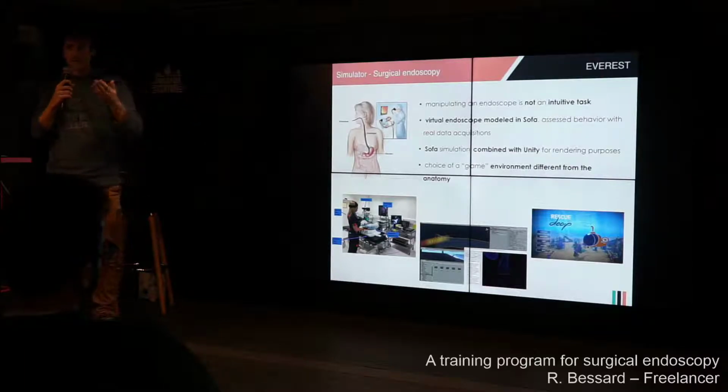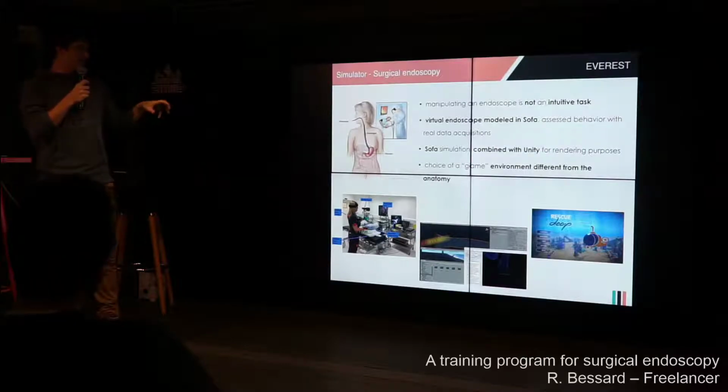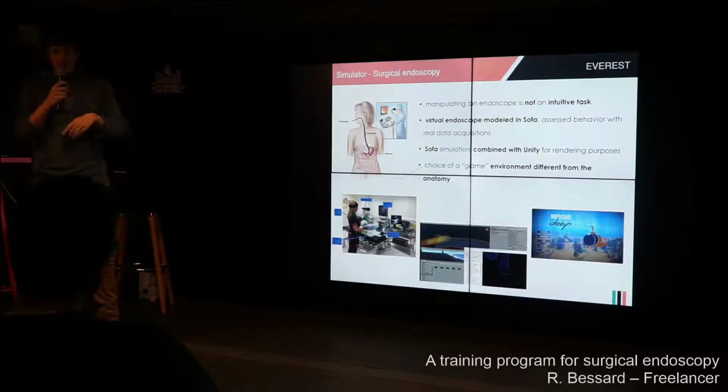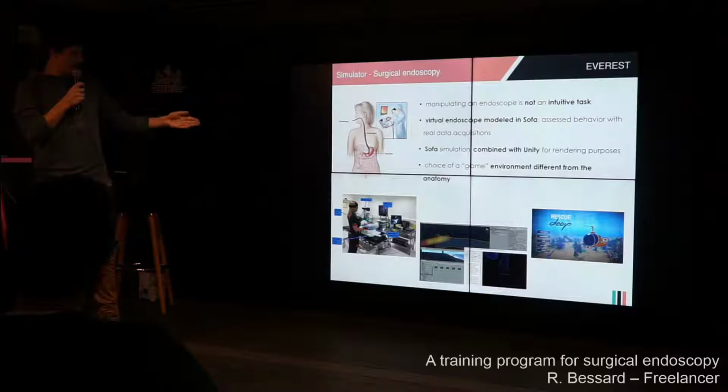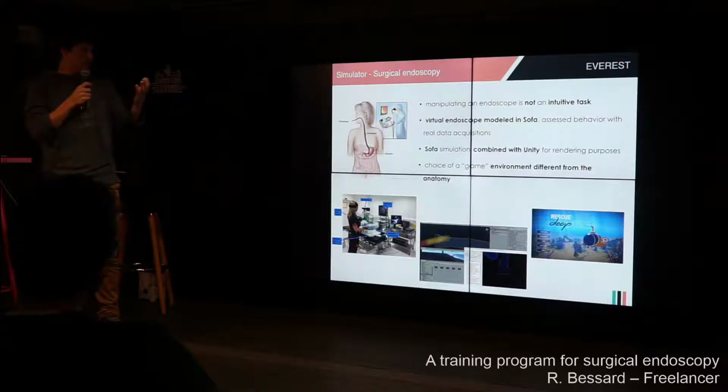So we used SOFA, of course. We modeled this endoscope in SOFA, and we were able to acquire real data from a real endoscope. Thanks to experts, we were able to assess that our endoscope in SOFA behaves the same way as a real one.